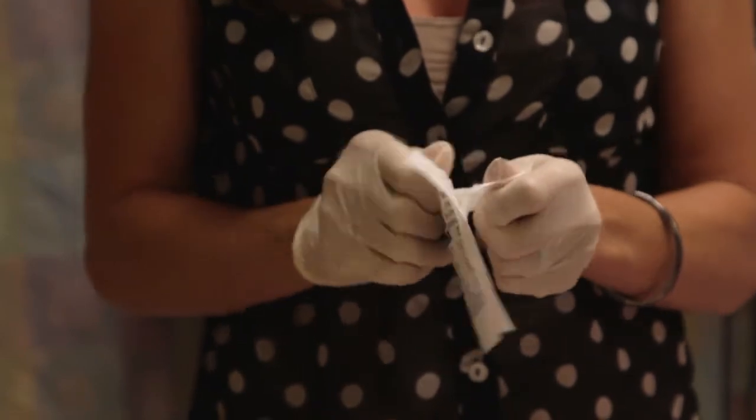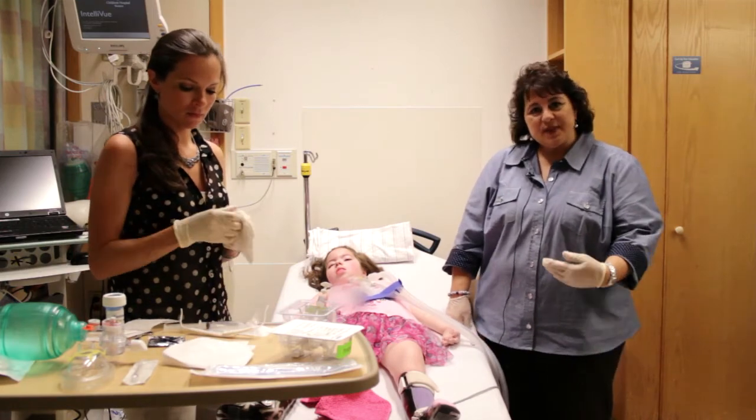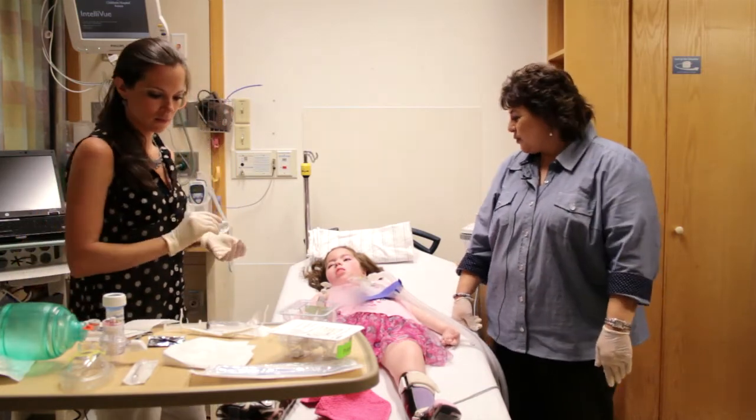April has the split gauze trach dressing for Drew, and she's got that now open and ready, and she has extra gauze to use to wipe the site between removing the tube and replacing the tube if there's any soiled secretions or anything there to be removed off the site.